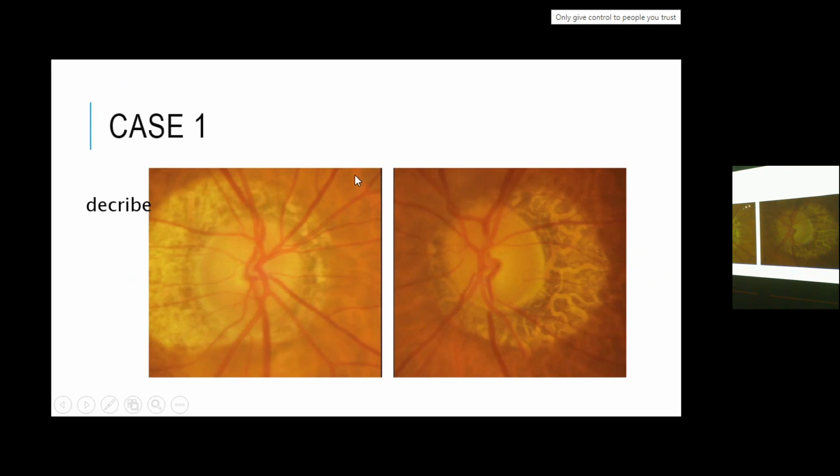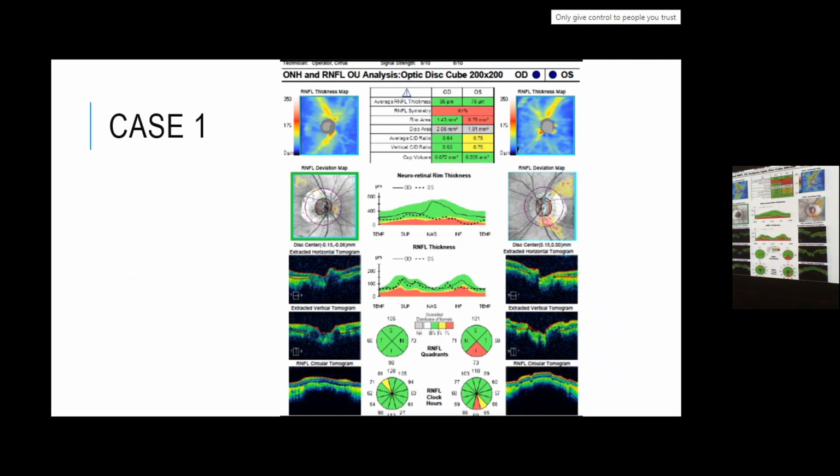So what do you expect in the OCT? Okay, so it's completely thinning in the left eye. I would expect the OCT to have inferior retinal nerve fiber layer thinning. Okay. About the visual field? The OCT, what do you think about it? Can you comment on it?